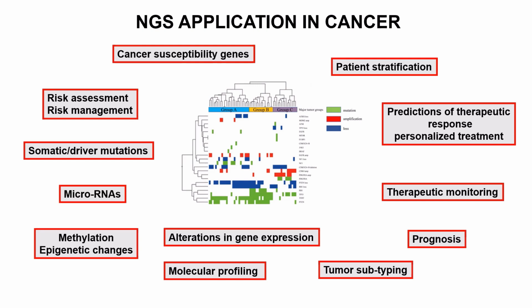Then, using NGS, we can also do targeted therapy selection. And so, NGS-guided molecular profiling can assist in selecting targeted therapies based on the specific genetic alterations present in a patient's tumor. Then, we can monitor treatment response. Then we can also use NGS in liquid biopsy. In fact, NGS-based liquid biopsy analyzes cell-free DNA or circulating tumor DNA from blood samples and provides a non-invasive method to monitor tumor burden, detect minimal residual disease, and track genomic evolution over time.